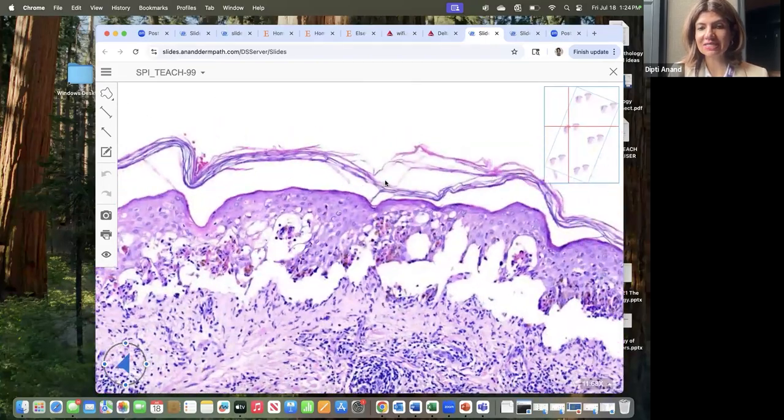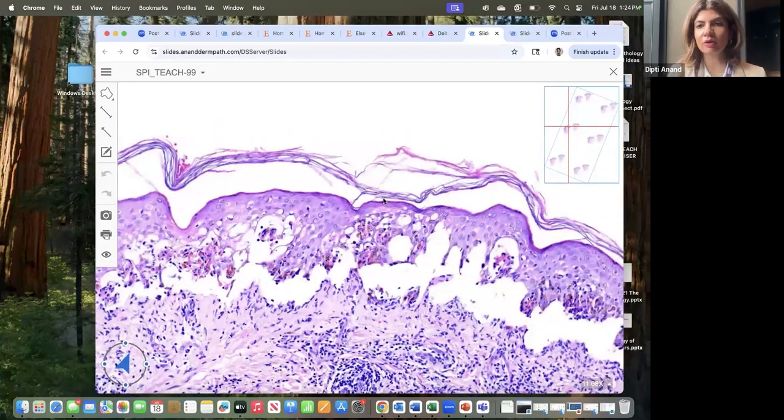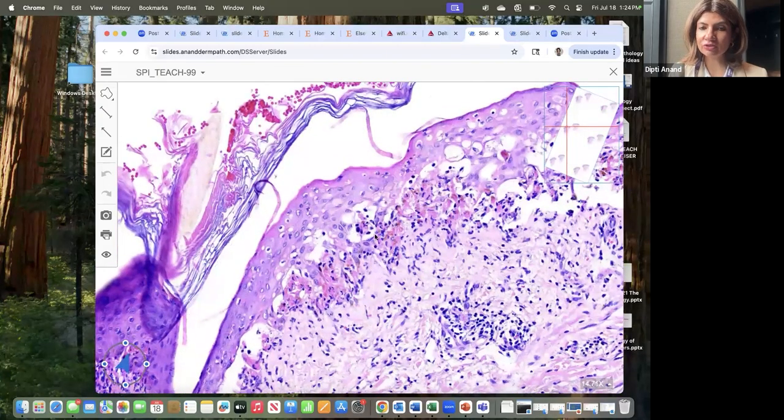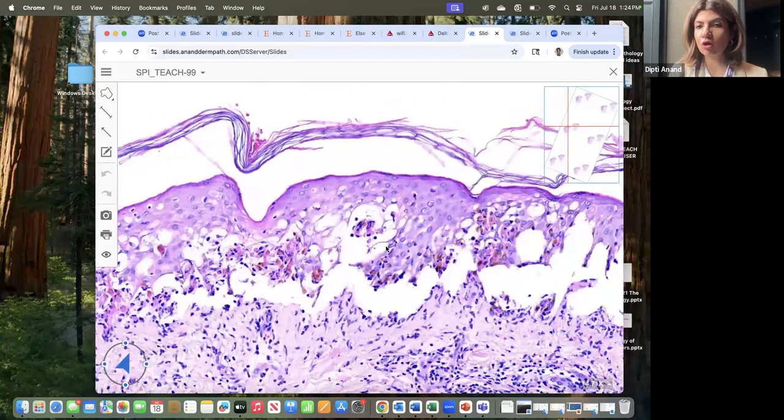So this is what is known as a lacy epidermal sign. And we'll talk about this more in your blistering diseases. You have a dead epidermis juxtaposed beneath an intact stratum corneum. So it looks like a lace. A dead epidermis beneath an intact stratum corneum. That is because of interface-mediated epidermal necrosis. You can see where the epidermis is more intact. You can see all these necrotics which are becoming confluent.